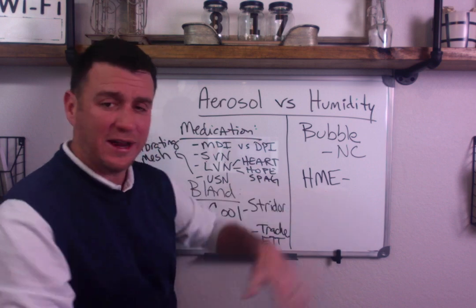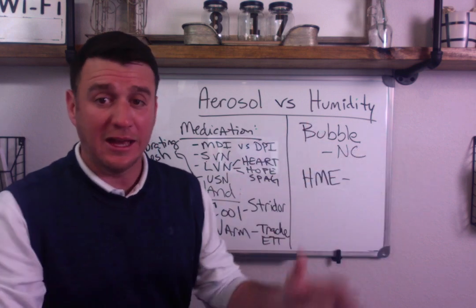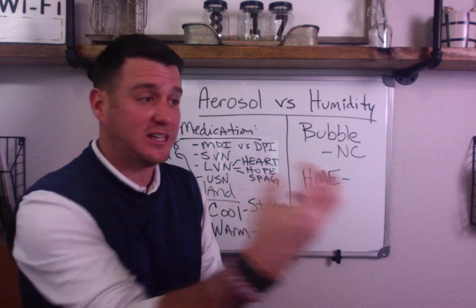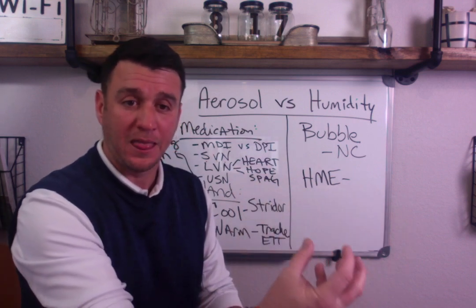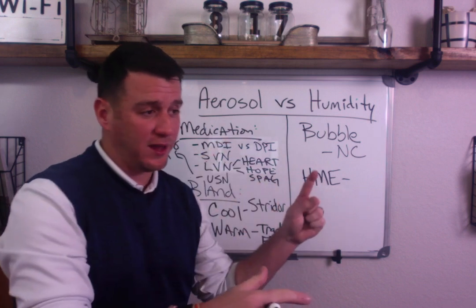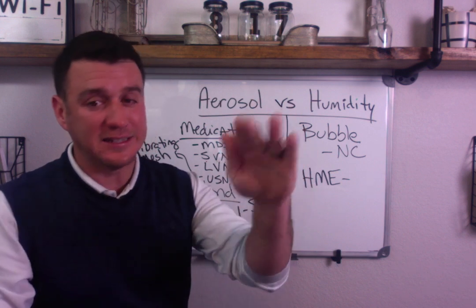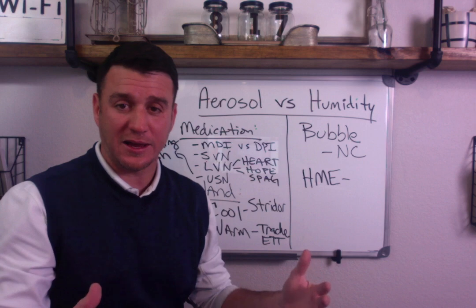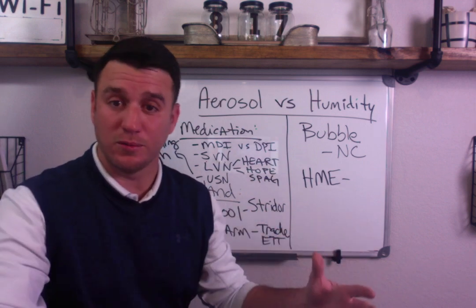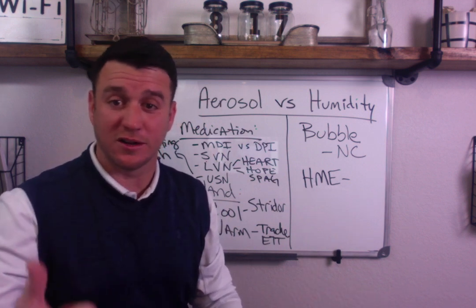Now, this works the same way as our nose. The gas goes into the patient, it passes over the HME, dry and cool. But when the patient exhales, the heat and the humidity from the patient is captured in the HME. When that gas is captured in the heat moisture exchanger, the next breath comes in and it picks up that heat and that moisture, and it is then delivered to the alveoli where maximum heat and humidification is desirable. All of this stuff works together to promote optimal mucociliary clearance.